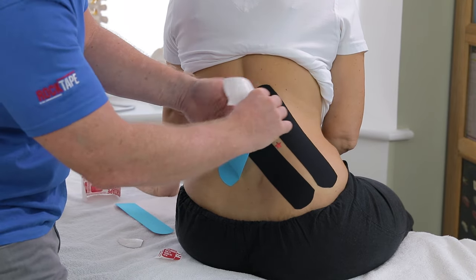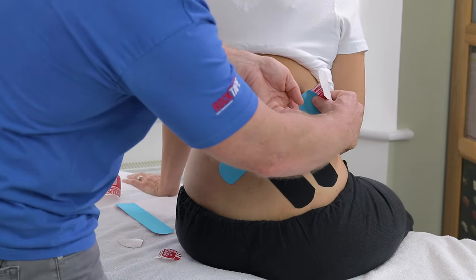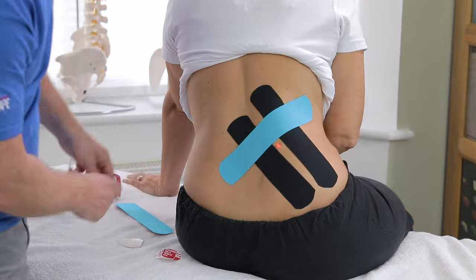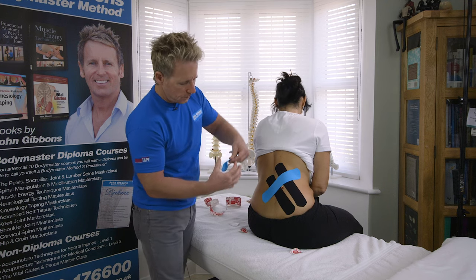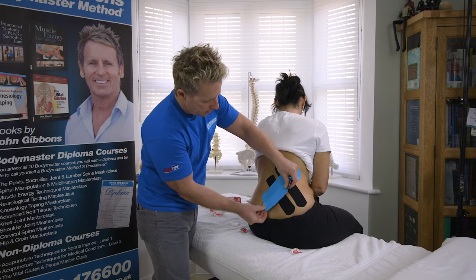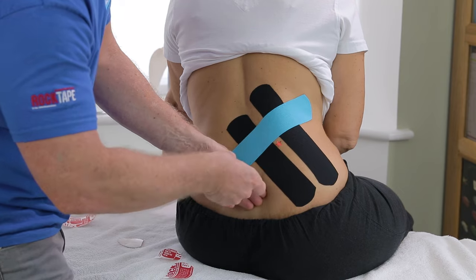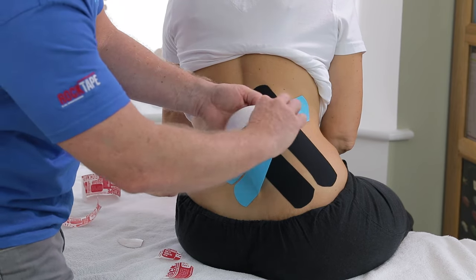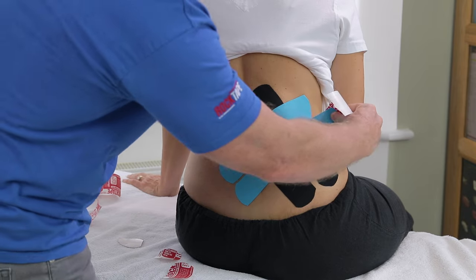For this third strip, I'm going to apply 50 to 75% stretch, crossing the area of pain and coming around. Then for the fourth strip, with a slight gap, I'm going to apply 50 to 75% stretch — starting at 100 and bringing it to 50 to 75 — across the area.